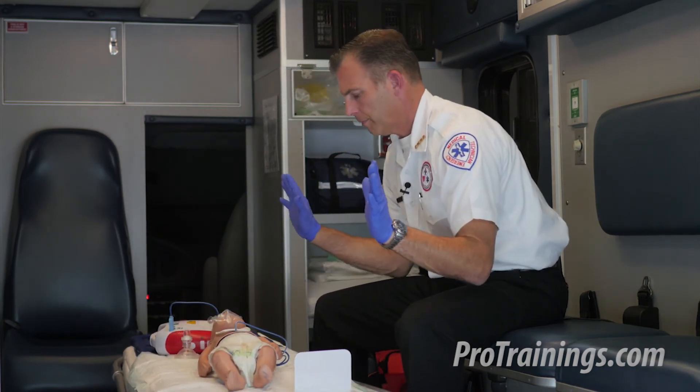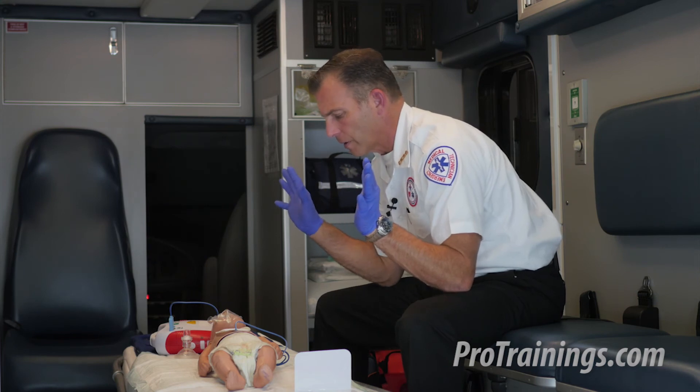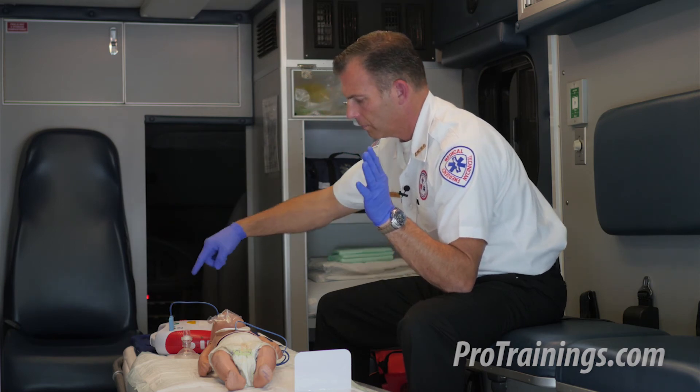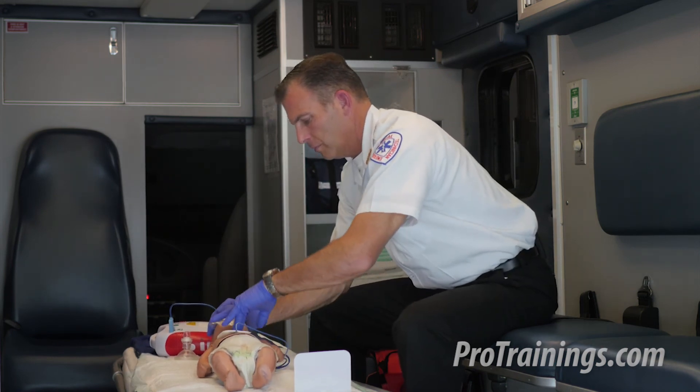Analyzing rhythm. Everyone stand clear — stop touching the patient and let the AED analyze. Shock advised. Charging. Everyone stand clear. Push the shock button. Shock delivered. Begin five cycles of CPR.